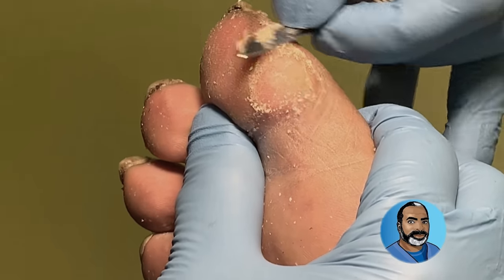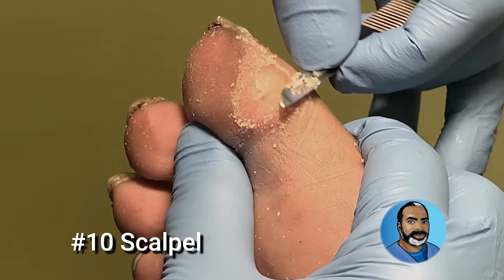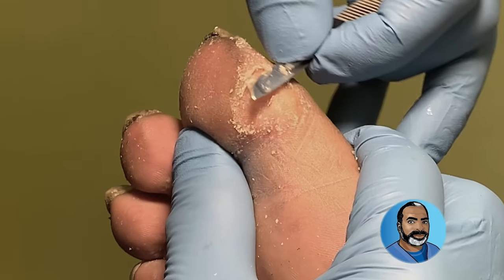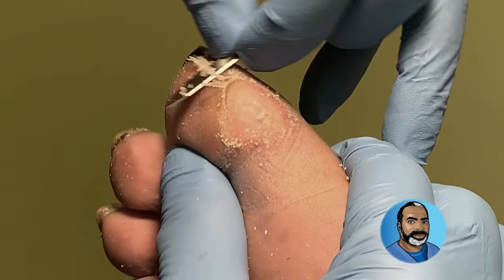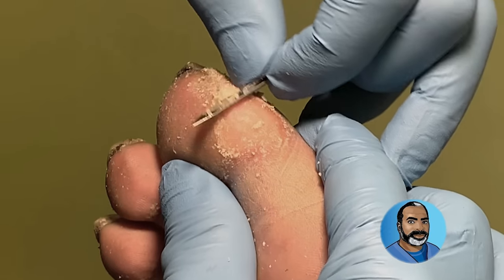This is the blade of the number 10 surgical scalpel used to finish the job. People ask me all the time where they can get this, and I always tell them: you should not get this. This is the same blade that's used in all manner of surgery, not just the feet, so it should not be used in untrained hands and it certainly should not be used at home.